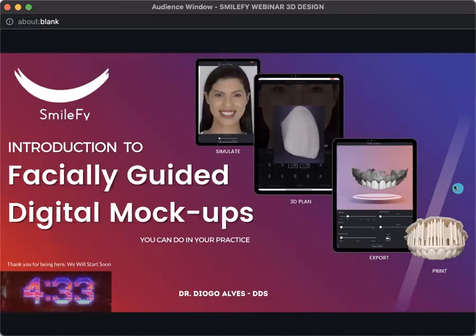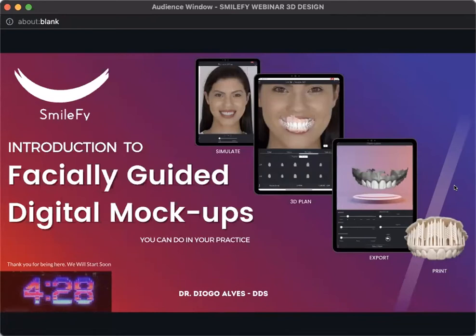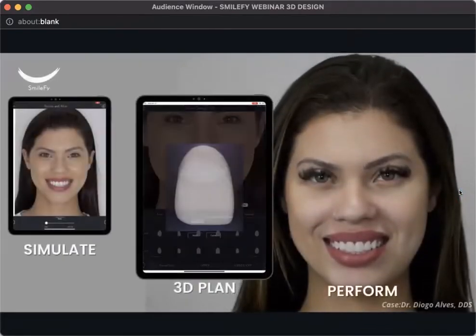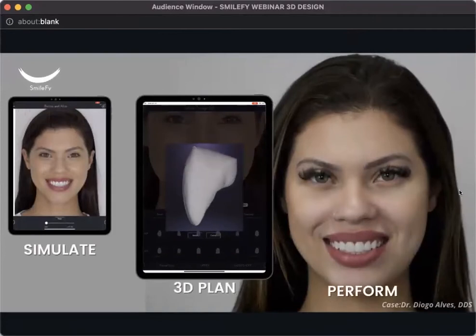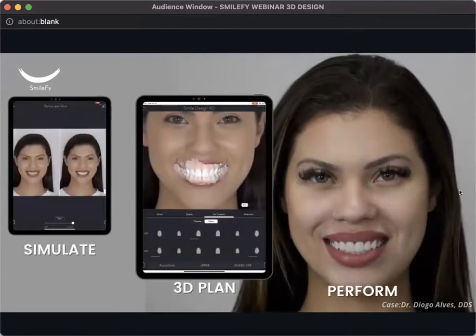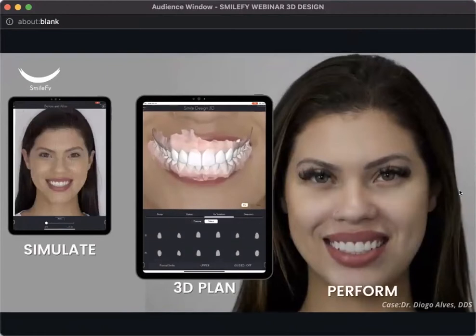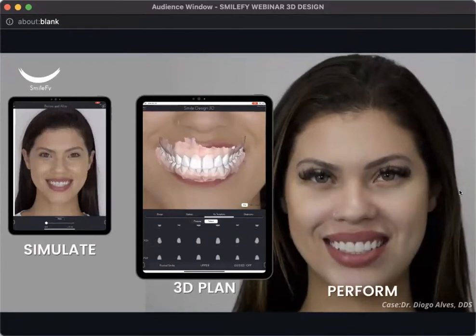If you are here today, it's because you want to also become a smile designer. So what I want to show you is a different type of workflow that every dentist can do in their practices. One, simulate your patient's new smile using the power of artificial intelligence. And I will show you guys in a couple of minutes how you can do that.